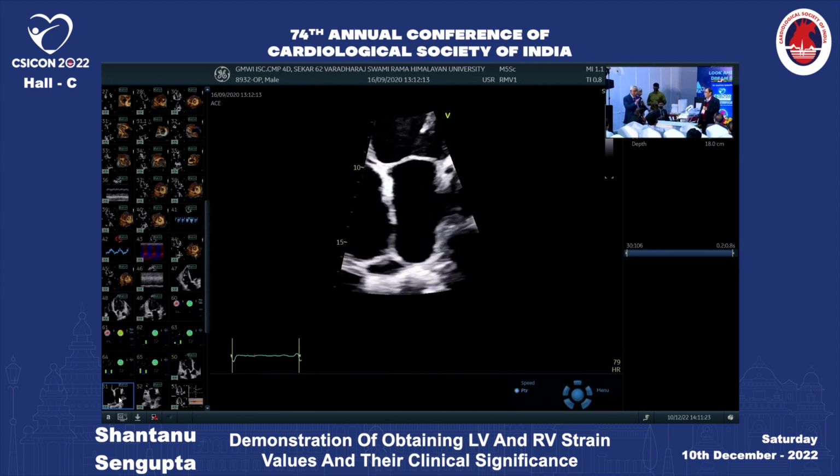There is LVH. The EF is normal, with reduction in the GLS. The patient has diastolic dysfunction, grade 1 going to grade 2. The LA strain is abnormal. I think that in the presence of LVH, many things are abnormal. You definitely do the same thing.